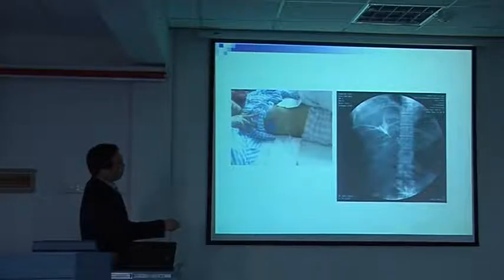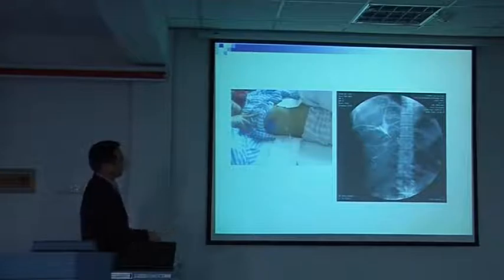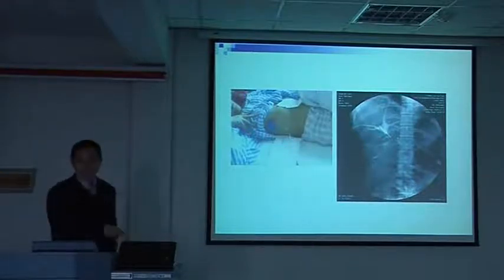This is the right anterior hepatic duct. This is the right posterior hepatic duct. But why? Because maybe there is an obstruction over the tract. Can't we use ERCP?